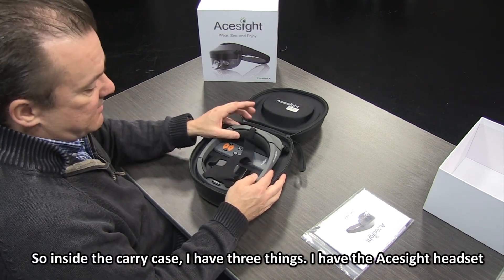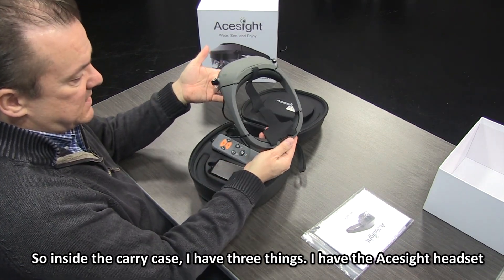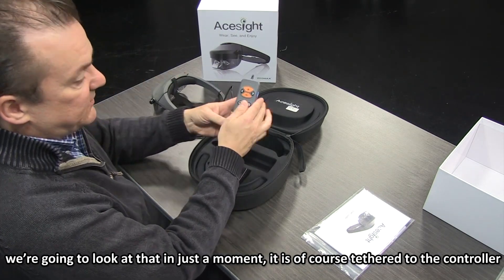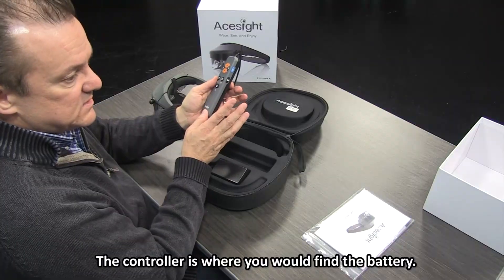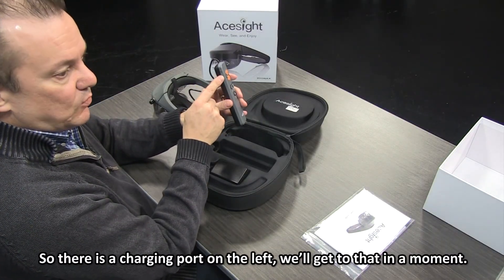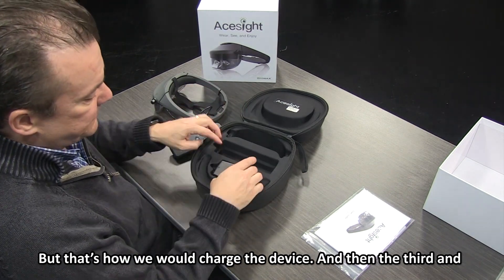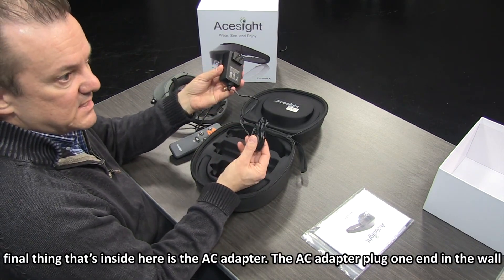Inside the carry case I have three things. I have the ACE Sight headset — we're going to look at that in just a moment. It is tethered to the controller. The controller is where you would find the battery, and there's a charging port on the left. That's how we would charge the device.